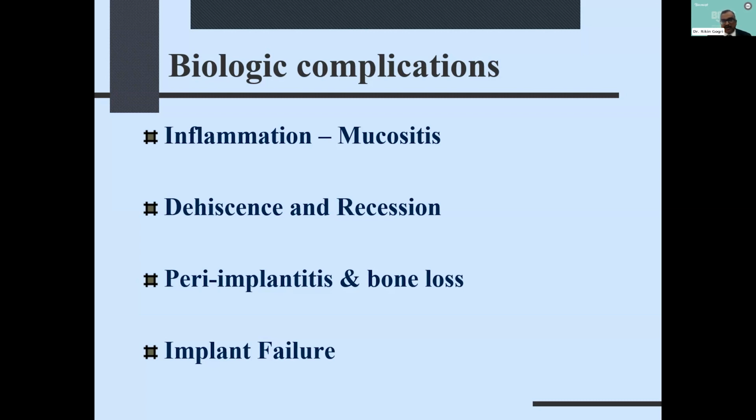Implant failure. An implant can fail at any given point. Even the best type of placement can fail. So you have no answer to implant failure. But once the implant fails, you will have to go for a higher or wider implant. And sometimes when you place an implant and there is bone loss, you will see that some threads are exposed. You can use a titanium brush for cleaning the exposed threads, and again use a water jet to clear the food debris every time the patient eats.